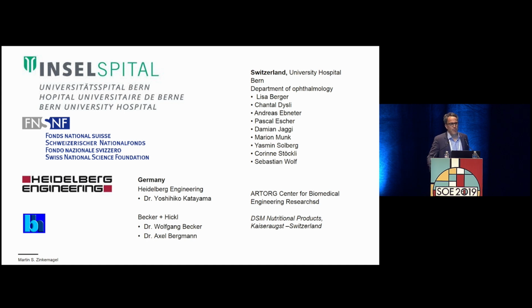So at the moment, because we're lacking any therapy, it's maybe irrelevant. But I think especially this foveal sparing, where you can identify macular pigment, and what we could show is that it quite nicely correlates with visual acuity. So if we would have something to treat these patients, this may be a parameter to monitor disease progression, like an outcome for a study, for example?